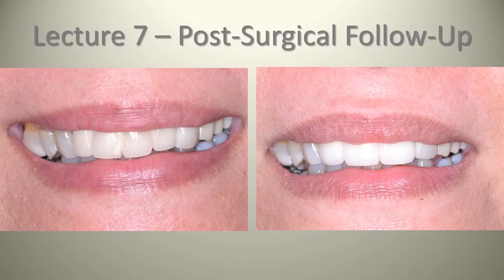In the picture on the right, you can see what we did. We were able to take that upper left cuspid that had moved mesially as a result of premature tooth loss and accept it as our lateral incisor, or at least mask it to look like a lateral incisor, using an all ceramic crown, and then give her a prosthesis supported by 4 implants. In this particular case, using the golden proportions, we were able to give this patient a result that looked much more cosmetically pleasing and also corrected that midline discrepancy. In the next slide, you'll see the case retracted.